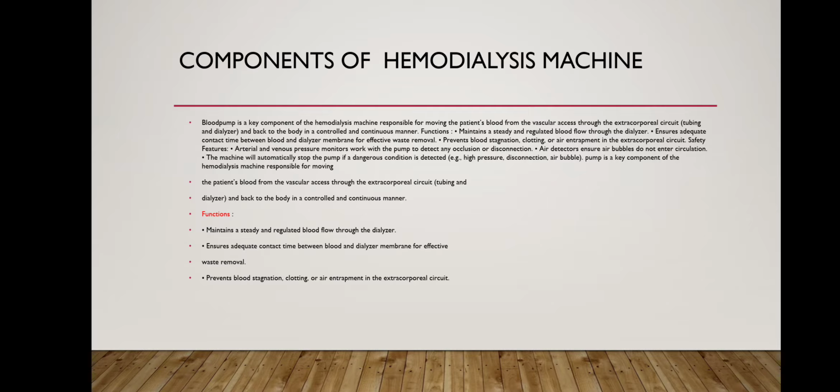The machine will automatically stop the pump if a dangerous condition is detected, for example high pressures and disconnections, which may cause air bubbles.